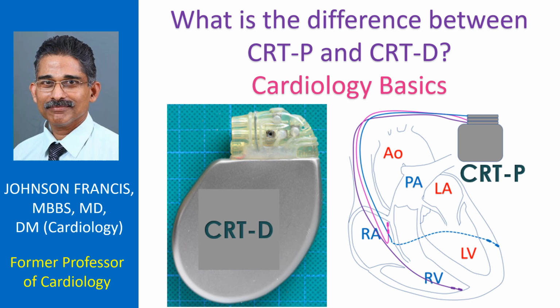In cardiology, CRT stands for cardiac resynchronization therapy. CRT is used in heart failure with reduced ejection fraction. According to the universal definition and classification of heart failure, heart failure with reduced ejection fraction has a left ventricular ejection fraction of 40% or less. CRT is a type of pacemaker in which three chambers of the heart are paced: right atrium, right ventricle, and left ventricle.